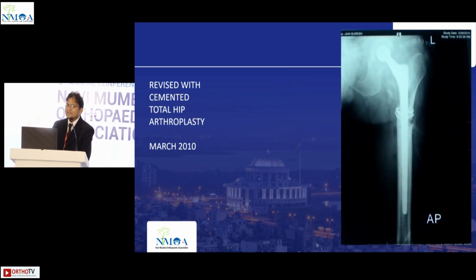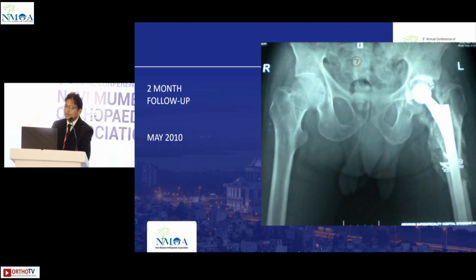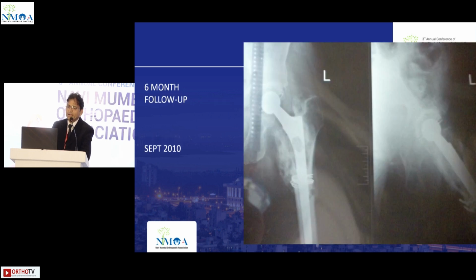And now you can see there is no medial wall to this particular shaft. The whole thing has been excised. It was all cemented. And fortunately for us, the callus grew there, and at 6 months you can see a good amount of callus there.